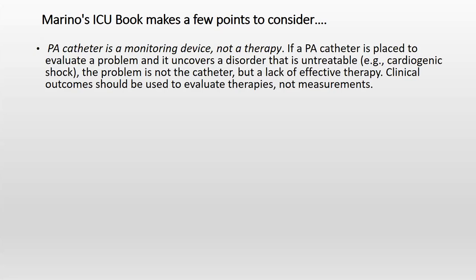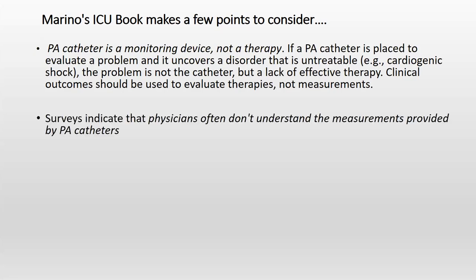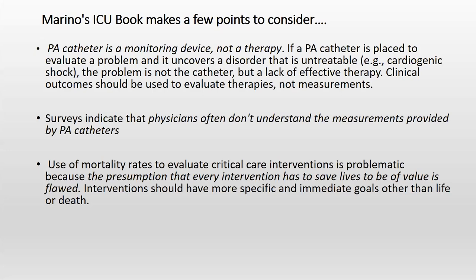So clinical outcomes should be used to evaluate therapies and not measurements. Surveys indicate that physicians often don't understand the measurements provided by the PA catheter, and that's one of the reasons it fails, because it's an understanding issue.